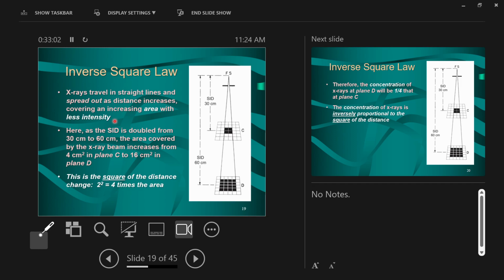That means for any given spot, any given square centimeter of area along that imaginary sphere, there will be less light intensity than a moment before that, okay? As the light moves away from the light bulb, it spreads out, okay?